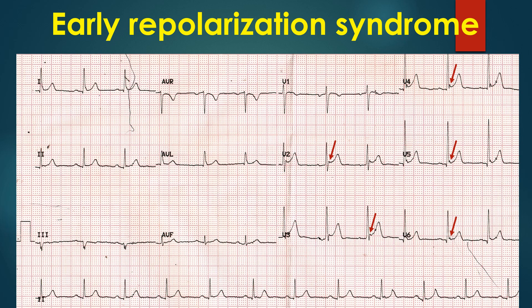An ECG showing concave upward ST segment elevation with a notch at the end of the QRS complex, or a slurring of the terminal QRS seen in lateral leads, is characteristic of early repolarization syndrome. J waves have been marked by red arrows.